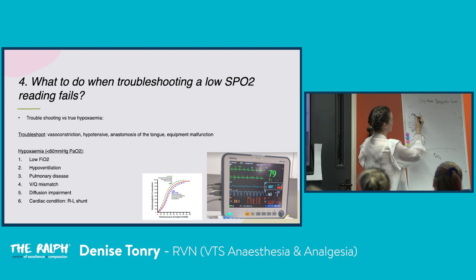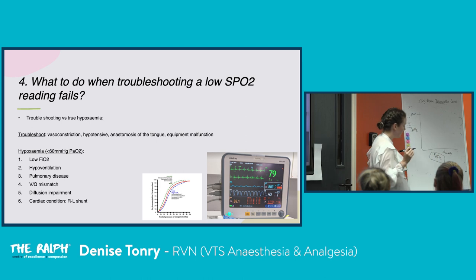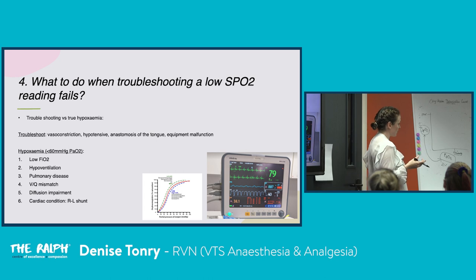So you have your 100% O2 up here, SpO2, and you have, let's say, 100 millimeters of mercury PaO2. A note about PO2: it's the amount of dissolved oxygen in the blood. So when we're reading an SpO2, we're indirectly trying to assess the dissolved oxygen in blood. And when we're breathing room air, which is 21% oxygen, our PO2 should be approximately 5 times that. So it should be 100. And that's why generally this graph comes up to 100, because we generally do this on room air. It's a bit more relevant on room air, but it gets really scary when it becomes relevant in anaesthesia on 100% oxygen.